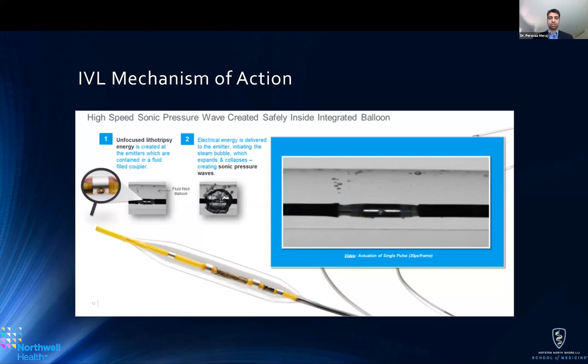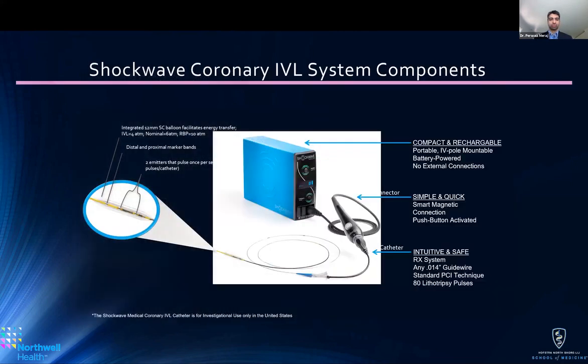For those of you who have not used it yet, its mechanism of action is really a high-speed sonic pressure wave created safely inside a balloon, and this is the device itself. So you can see here the balloon, and there are these pressure waves that are created once the balloon is inflated, and that energy is emitted at a certain rate. People may be familiar with this from renal stones, and it's a similar concept, obviously with a different utilization. This is the system itself.